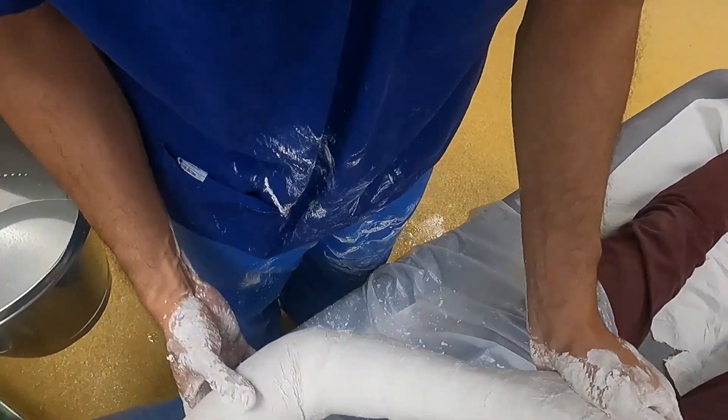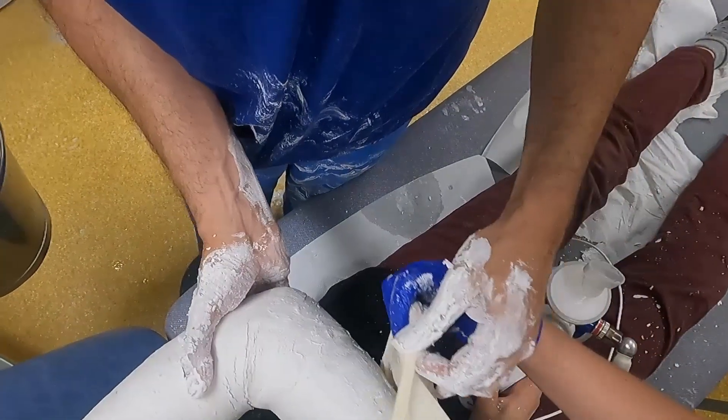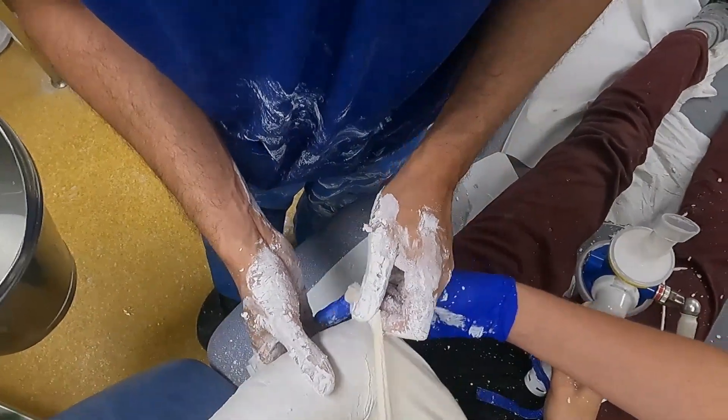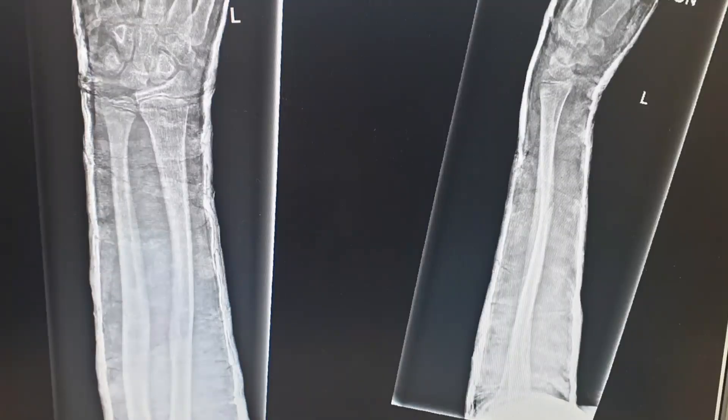Following moulding of the cast, the elbow is then placed into a standard sling for comfort. Post-reduction films revealed an adequate alignment on orthogonal planes.